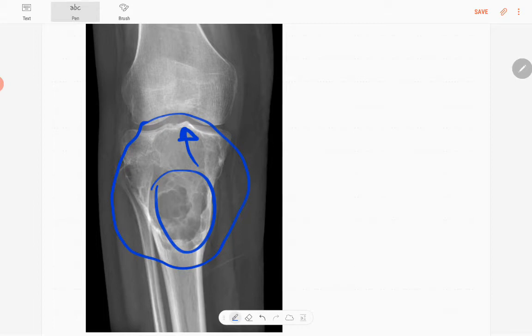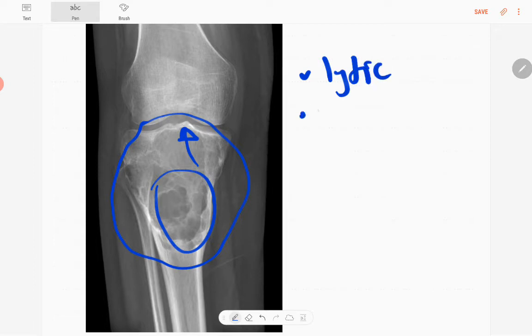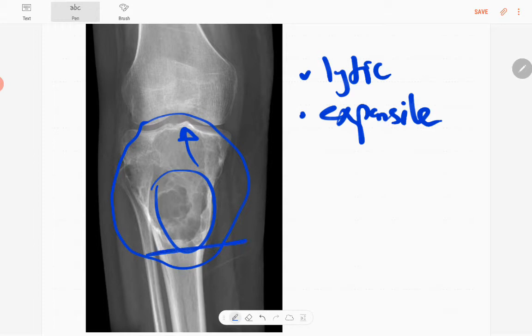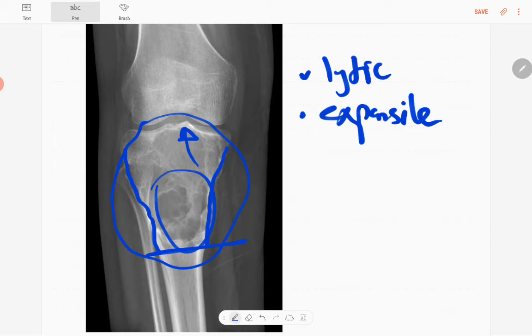The lesion is expansile with a multi-lobulated appearance and has a narrow zone of transition. There is endosteal scalloping of the cortex in this region. However, there is no cortical breach, which is a benign feature.